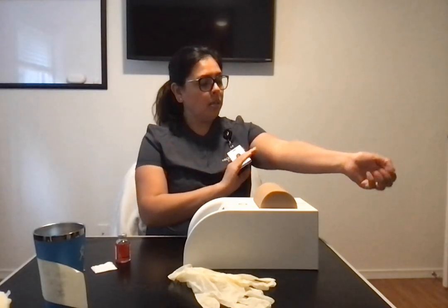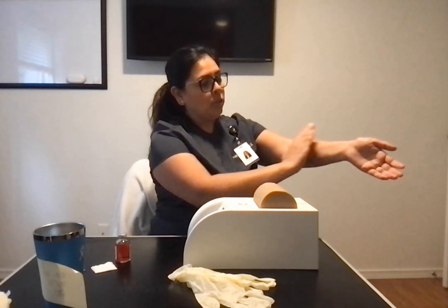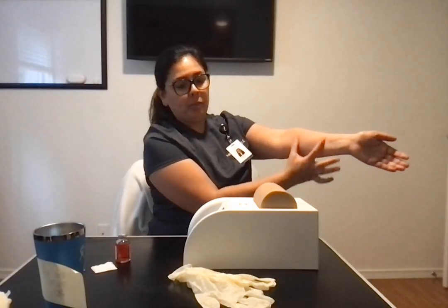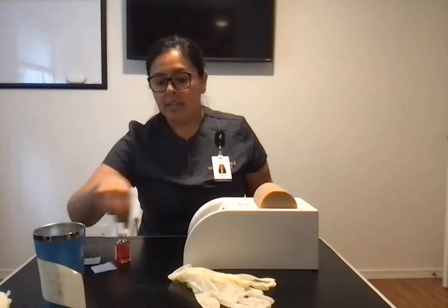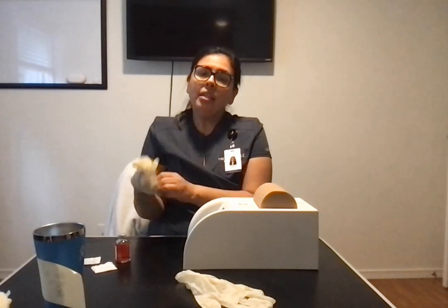So to place this medication, you want to use your antecubital site and your wrist as landmarks. So you want to go about 4 fingers from the antecubital site, but also maybe a hand width away from your wrist. So somewhere right in here is where we're going to be injecting, and that will be right here for the patient. So next we're going to perform hand hygiene again. Now that I've found my location for the medication, apply clean gloves.